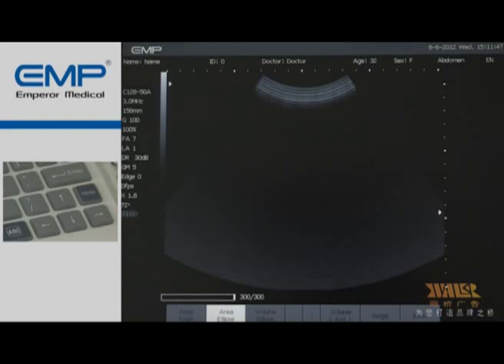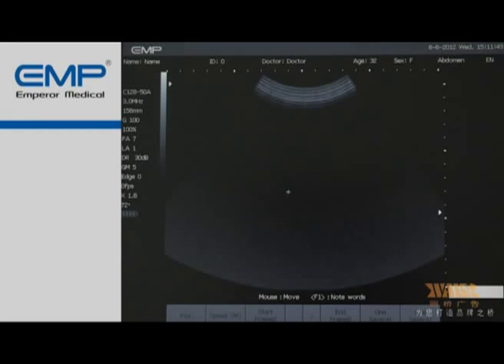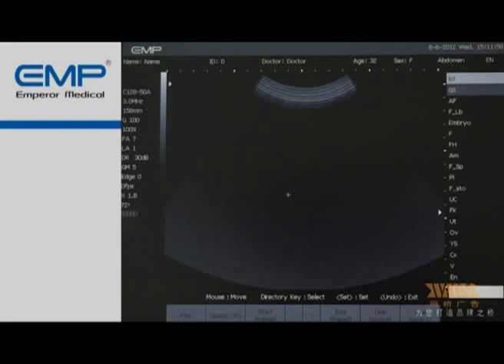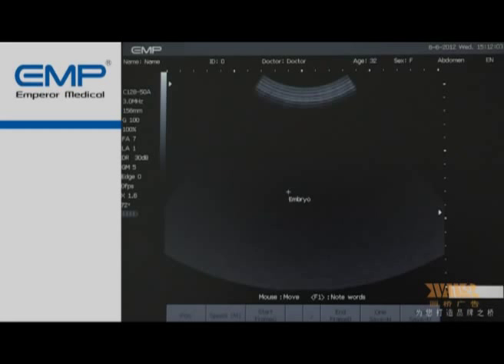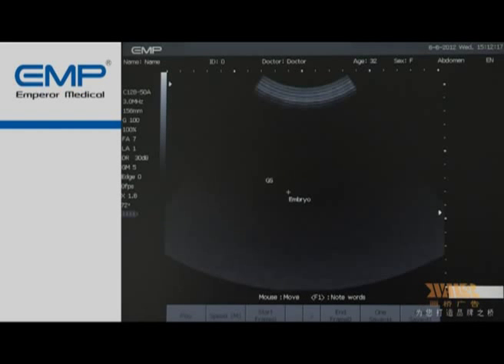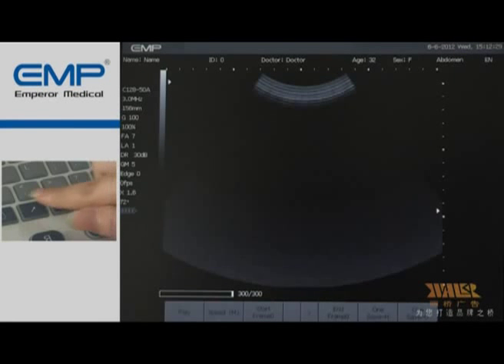Press the keynote key on the small keyboard area to enter text editing. Many medical vocabularies can be transferred from the device's database. In the note editing interface, press F1 to display the vocabulary database in the system hint area, and press the up-down key to choose the appropriate item. Press the left or right key to flip. Then press Set to display the chosen item at the location of the blinking cursor.